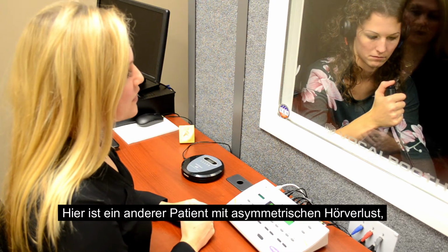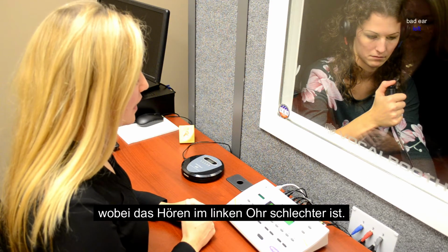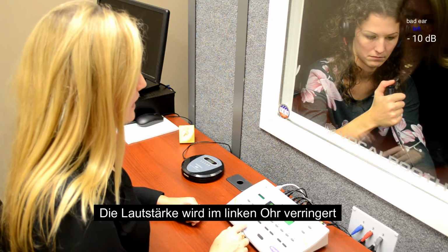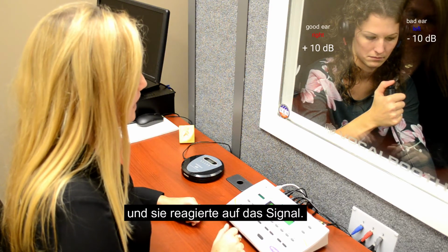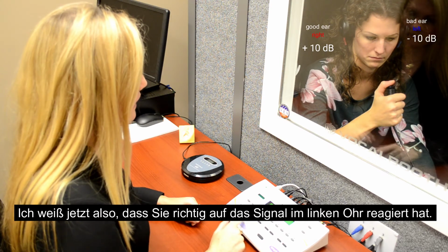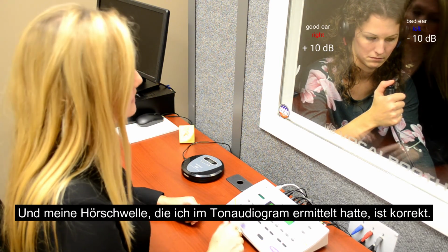So now we have another patient with an asymmetric hearing loss that's hearing is worse in the left ear. So I'm going to do the same thing where I decrease the signal on the left side and increase the signal on the right side. I'm going to present it, and she pressed the button, so I know that she is responding appropriately on that left side, and the hearing that I had in my first test is correct.